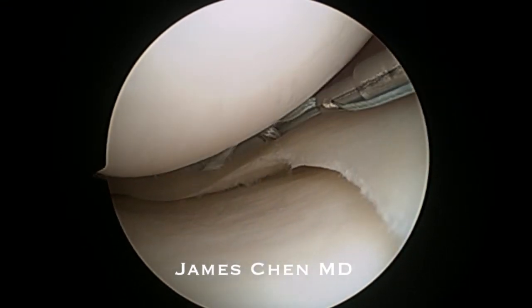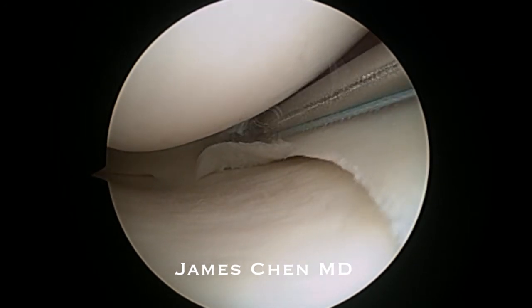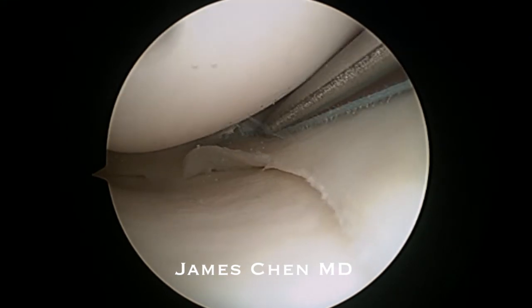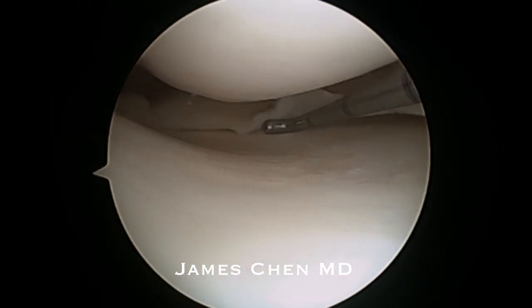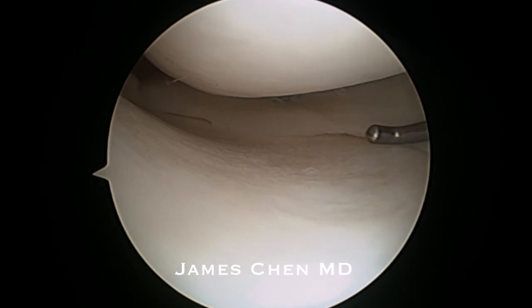Here I am tightening the cinch knot and you will see the suture tighten up. I then follow with a cutter and cut the suture. I then probe the meniscus and you can see the meniscus repair with the Speed Cinch from Arthrex.